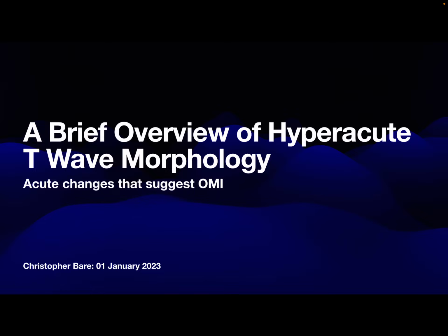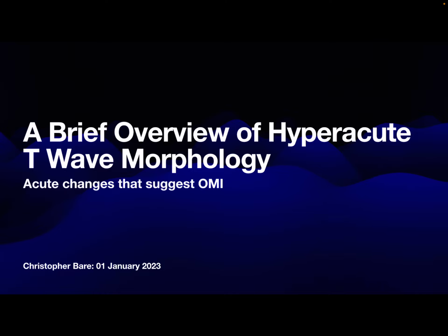And just to emphasize yet again, anytime you have acute dynamic or hyperdynamic T-wave changes in a patient with signs and symptoms that suggest an acute coronary syndrome or myocardial ischemia, they should be taken very seriously.